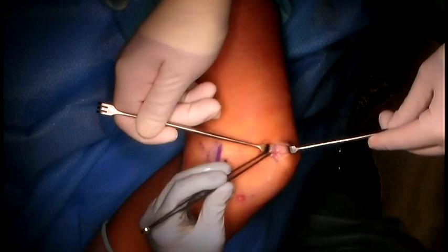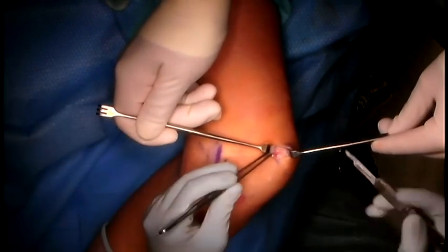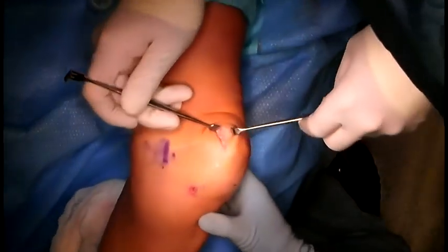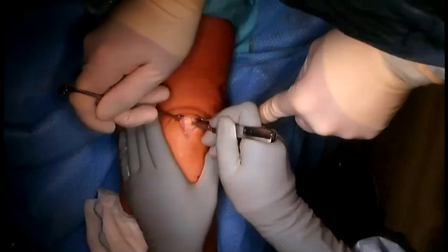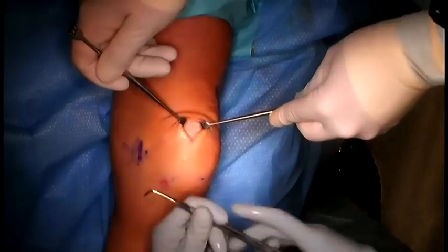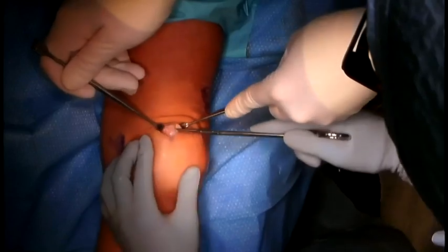Through a 1-inch incision centered over the supermedial border of the patella, a small incision is made at the junction of the medial border of the quadriceps tendon and the patella through layers 1 and 2. Another incision is made at the distal quadriceps tendon in a partial thickness fashion at the junction between the medial and central thirds of the distal quadriceps tendon attachment.